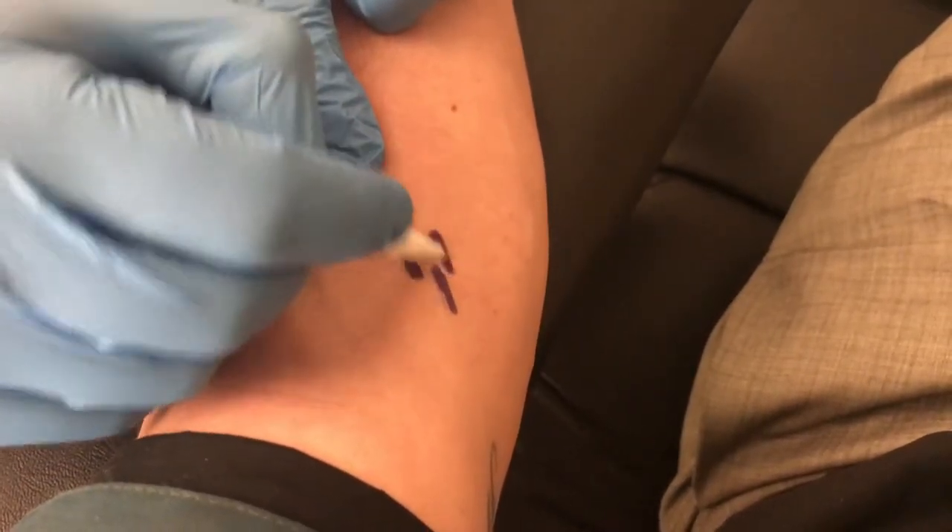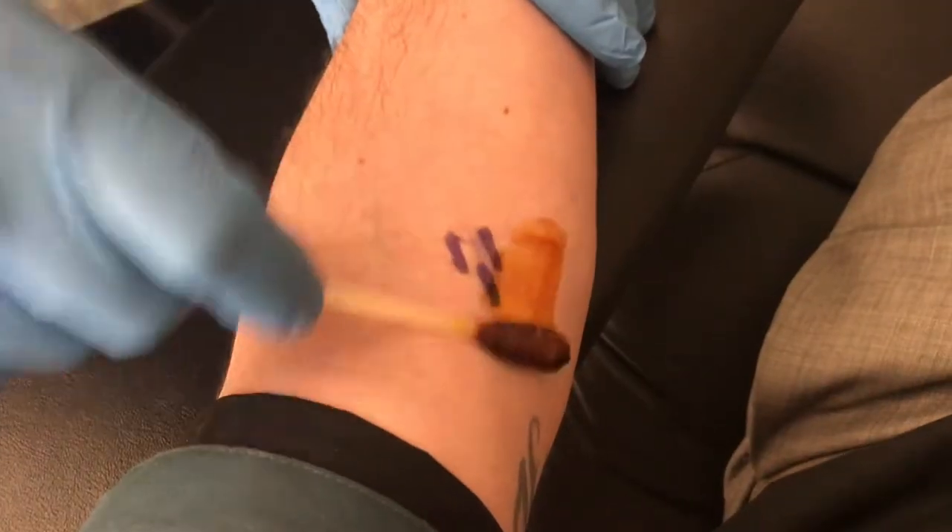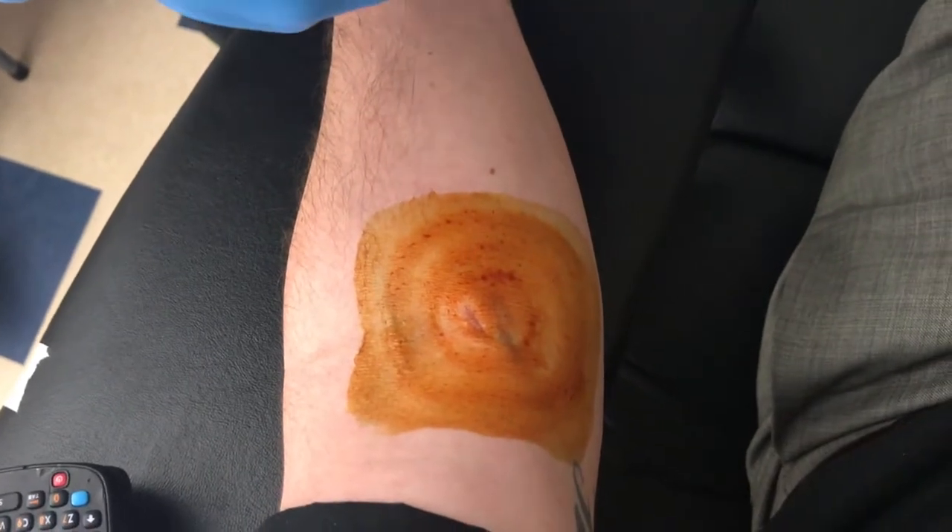Then they thoroughly clean the surface of your skin. If you don't like needles, you should probably look away right now — you've already seen it in the intro — but this is the part where they stick the needle into my vein.